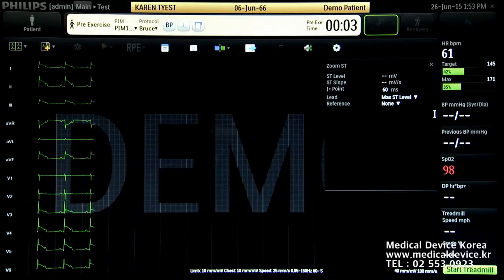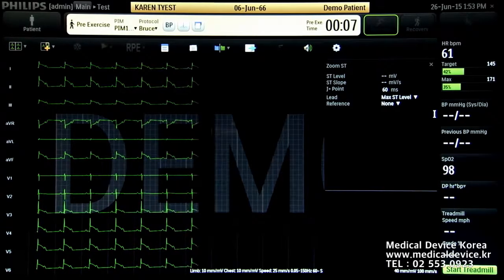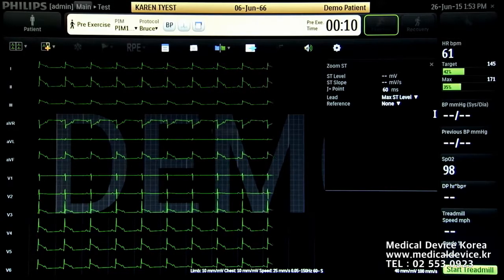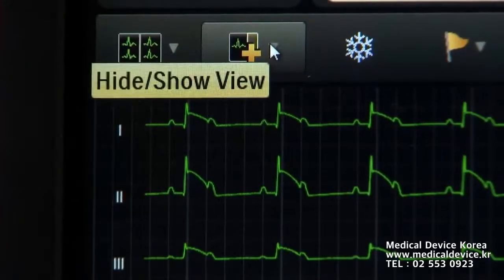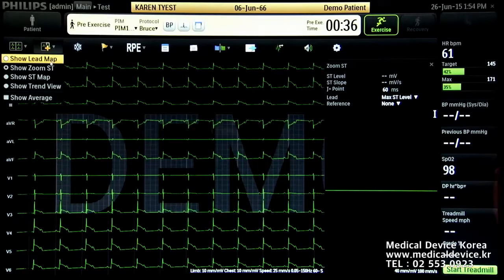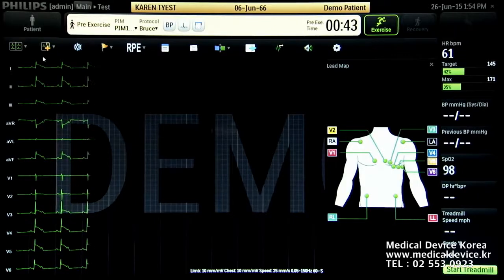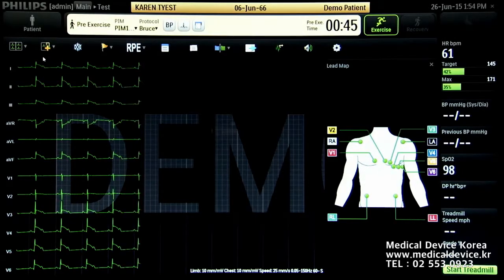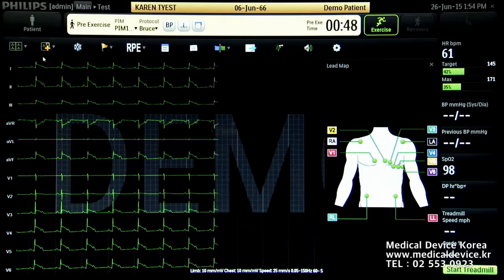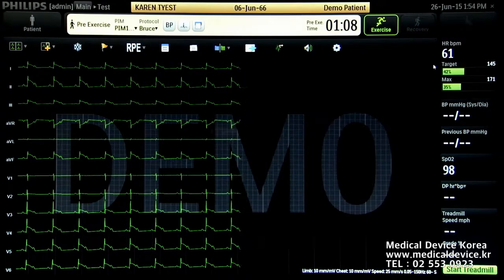The patient is connected to the patient interface module and lead sets. We want to ensure correct lead placement. Select the hide/show view icon and turn on the lead map by selecting the show lead map option. The lead map shows lead continuity — green for good, yellow for poor.